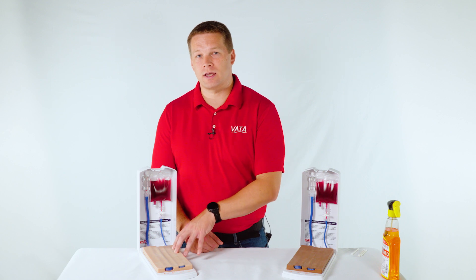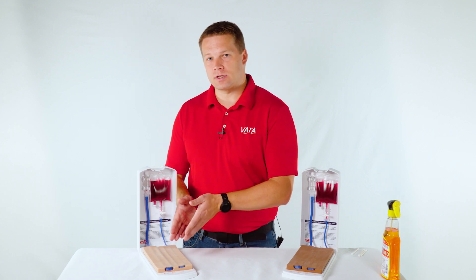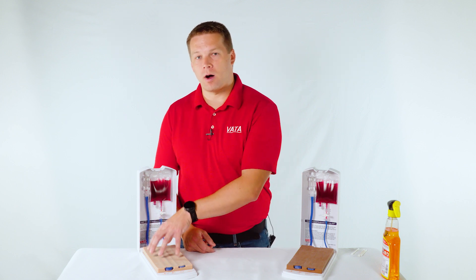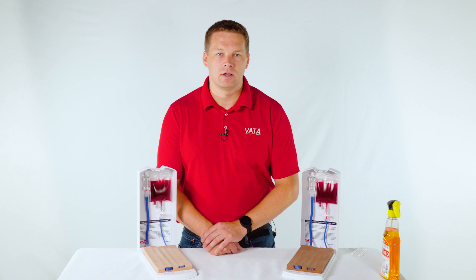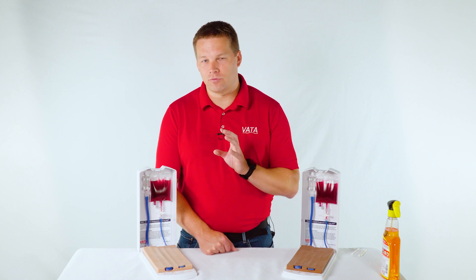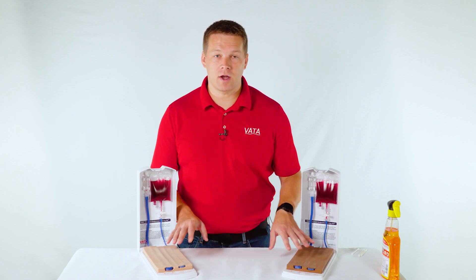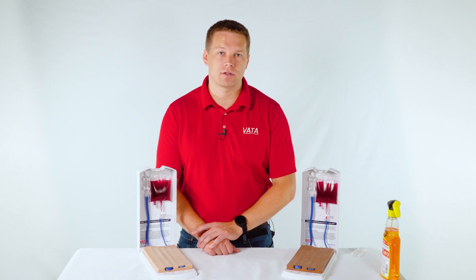Many people also use these in conjunction with full IV arms. Typically they do the bulk of their accessing on this model — since it holds up to needle sticks better and has a lower price point — and then do the final check-off or final training on the IV arm, where they can practice anatomical locations, putting on a tourniquet, and other elements. Whether you want to switch to these entirely or use them alongside IV arms, they are a great option with a lot of really nice features. If you have any questions on either model, you'll find more information on our website or you can reach out to us and we'll be happy to answer. Thank you.